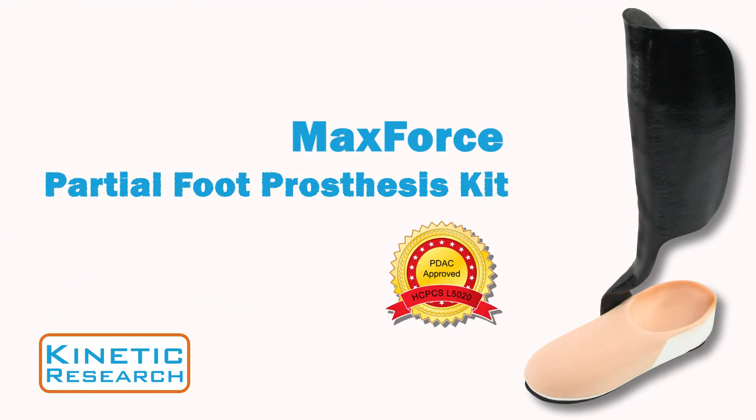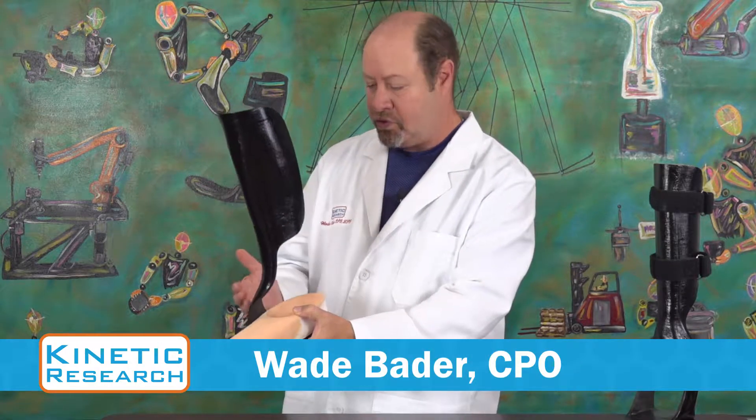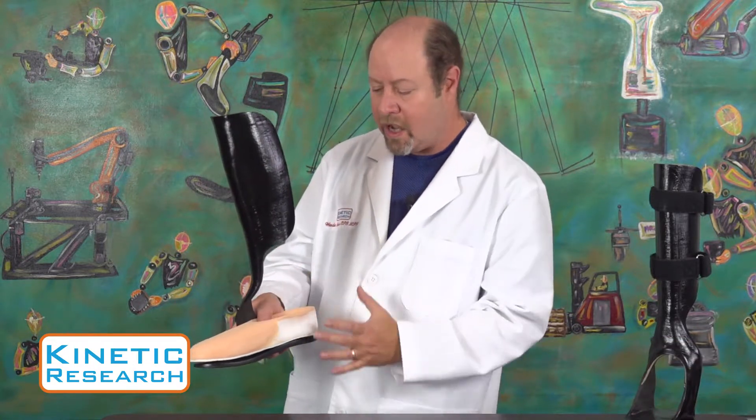This is our MaxForce partial foot prosthesis. It's a unilateral strut usually positioned on the medial side, because partial foot amputees tend to turn out a little bit.